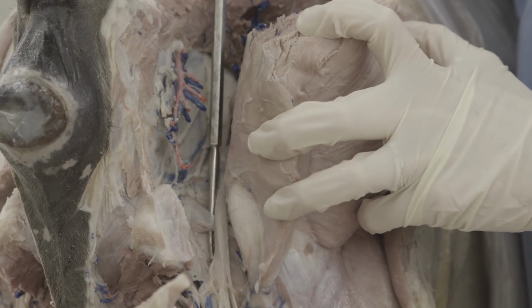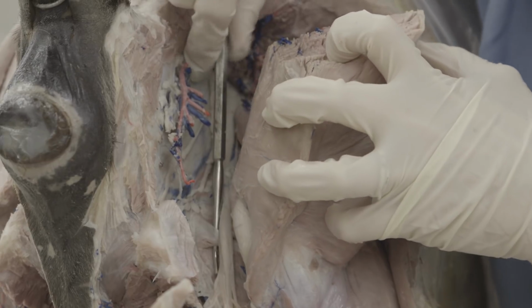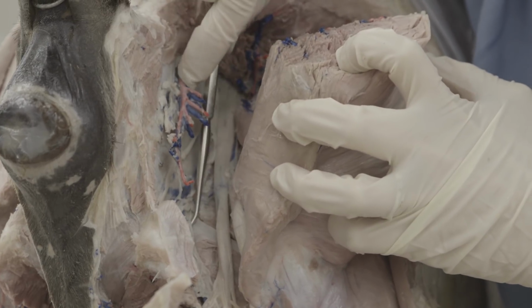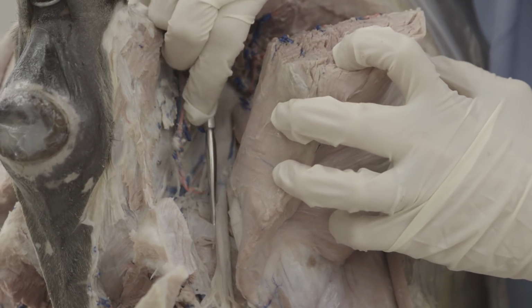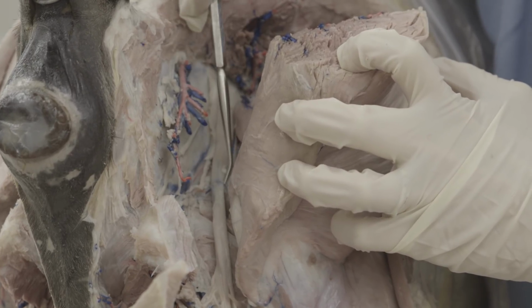So here we're taking a caudal view to see that internal obturator tendon coming through the lesser sciatic foramen. So I have the probe underneath the tendon of the internal obturator, and you have the lesser sciatic foramen right here where the probe is kind of sticking through. So lesser sciatic foramen, tendon of internal obturator coming through and running underneath this sciatic nerve.